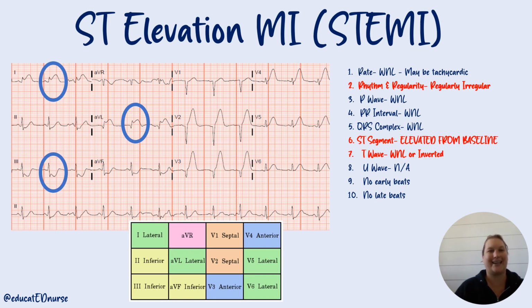This EKG shows that they're having an MI, so they are definitely having a heart attack. If you see ST elevation, where the ST segment is not at baseline and is elevated, that needs to be addressed and brought to the physician's attention ASAP. In this particular EKG, there are no U waves, no early beats, and no late beats.